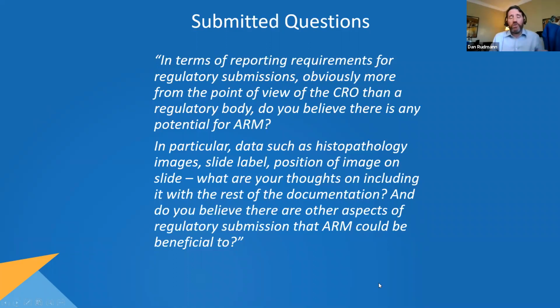And let's say you use ARM for that instead, and it quantifies that Ki-67 readout, and then you include that in a pathology report. That would be a raw data source for that pathology report.